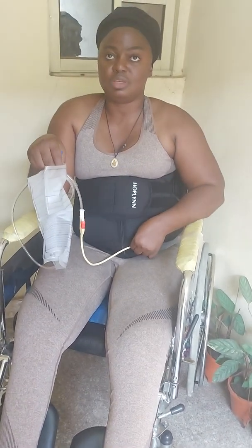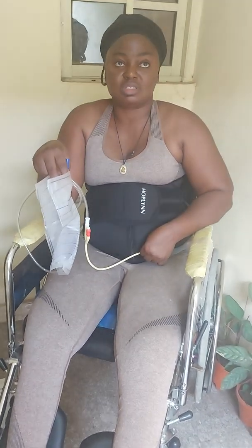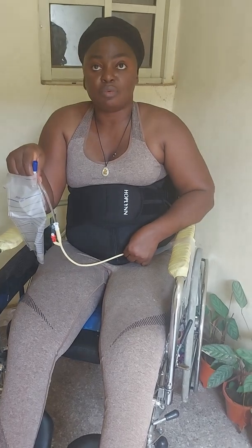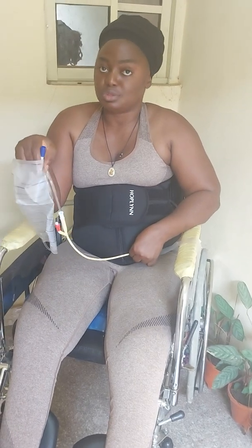And for suprapubic, in my own case, I change every 8 weeks based on doctor's instruction, and some is 6 weeks, some more, just depending. And this is something that, yes, if we are well directed, you can actually do this changing of catheter by yourself in the house, but we're not going to talk about it.